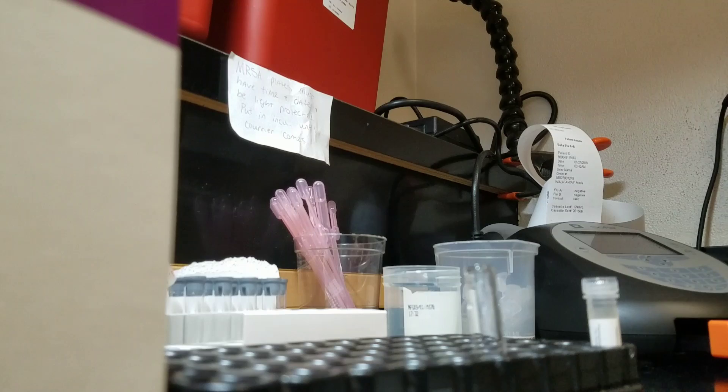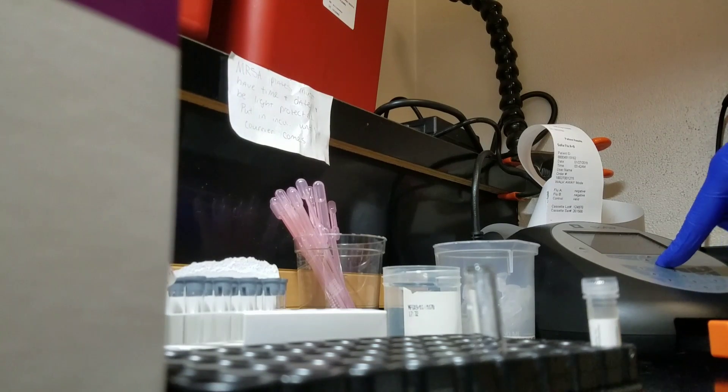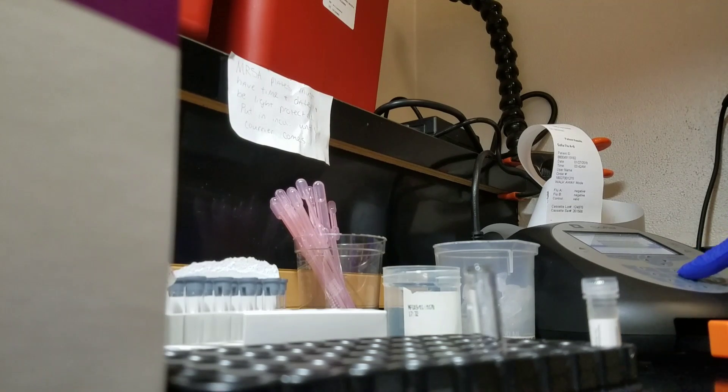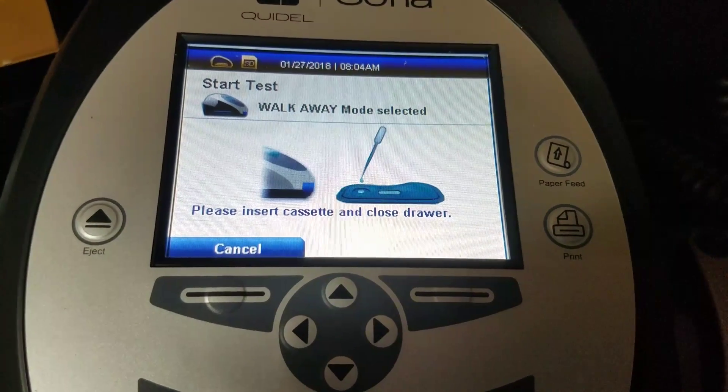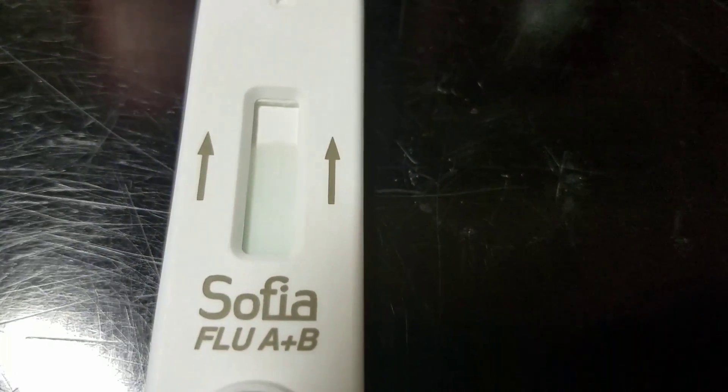Then we will take our clear pipette and pipette from our mixture into our cartridge. Now that that's done, I'm going to put in my user ID, the patient ID, and the order number — since it's a survey, I'll just put in the number there. I'll press start test and here's what the screen looks like. It says walk-away mode selected — please insert cassette and close drawer. Here's our cassette; as you can see, it's already starting to migrate. We do want it on walk-away mode since we don't have a bunch to do right now.